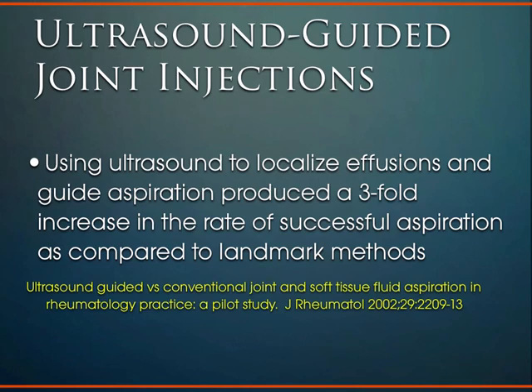I mentioned earlier, in terms of the application of ultrasound in the office, one use is image guidance for joint injections. We've been doing joint injections for a long time using surface anatomy and your knowledge of it to guide your injection and identify the joint space, the tendon sheath, and your soft tissue structures.